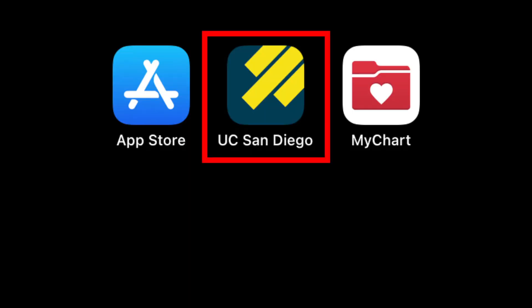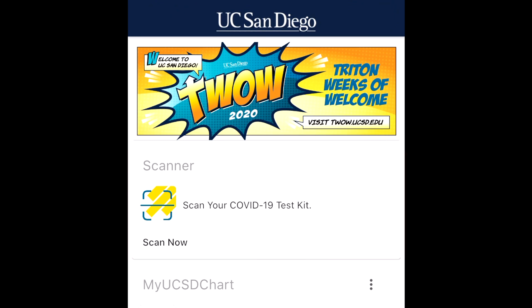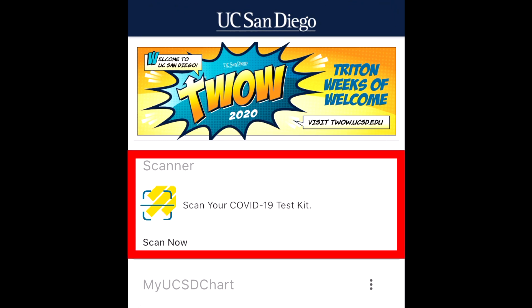Once you've downloaded the UC San Diego app, log in using your UC San Diego credentials. To scan your test tube, click on 'Scan your COVID-19 test kit' at the top.